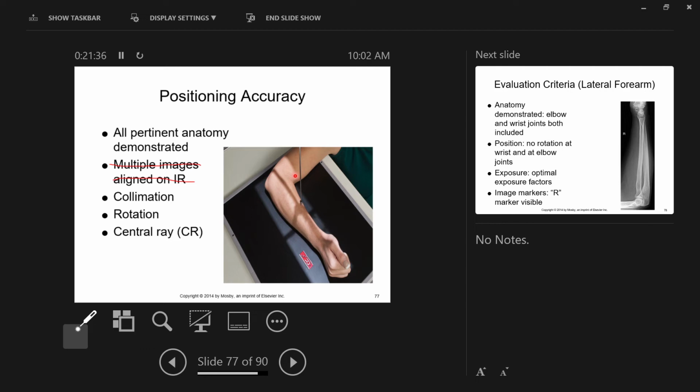So in general, we always want to show at least 2 sides of a collimated field on the image. And when we can show 4 sides, like this shows, where you can see all 4 edges of the collimated field inside the receptor, that's ideal. There are times when that can't happen, such as adults and chest x-rays. Often you can't make the field smaller because our chests are about the exact size of the image receptor. And in other cases, that's not true. But collimation is extremely important.